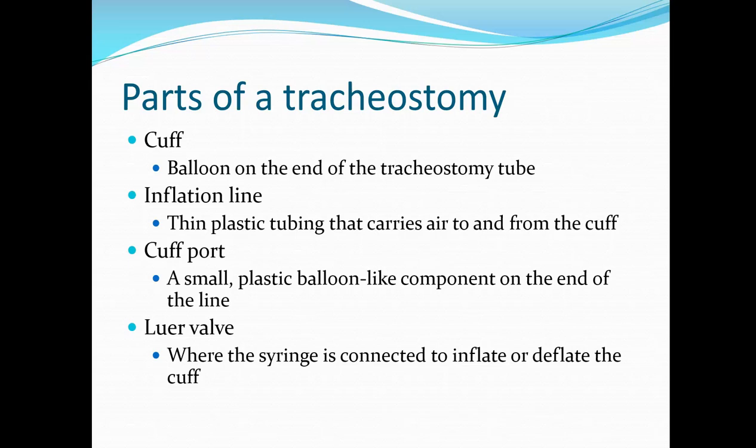Okay, so parts of the tracheostomy. So there's a cuff, or not all of them have one, but kind of like what we talked about with the ET tubes. There is a cuff on the end of the tracheostomy tube again to help hold it in place.